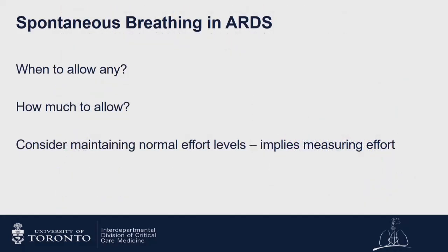So questions: when do we allow spontaneous breathing? How much to allow? And another factor to consider is if we say, well, let's maintain normal effort levels, that implies that we have to actually be able to measure effort. Next slide.